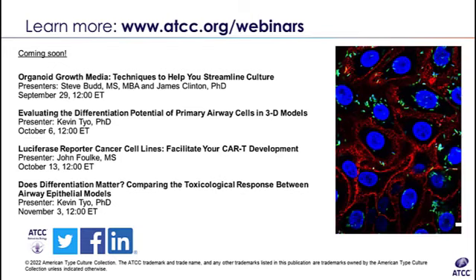There's a couple ways to look at it. We have multiple vials of frozen down cells, which all came from the same batch of cells. So it sounds like someone's adhering to the seed stock principle here. Some vials grow up to their 30th passage with no problems, but we have random times where cells begin to round up and die within 4 passages of thawing. Any idea why this could be? How to test for this beforehand, maybe? And they said that the cell line they're using is U2OS.